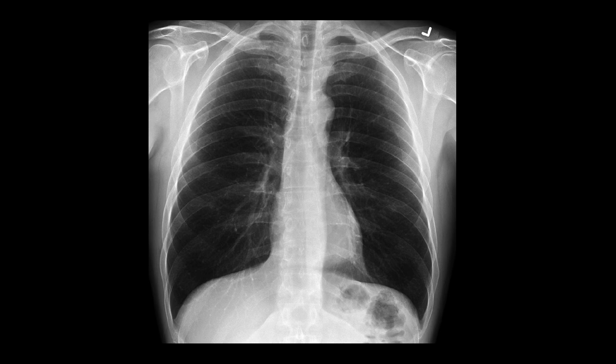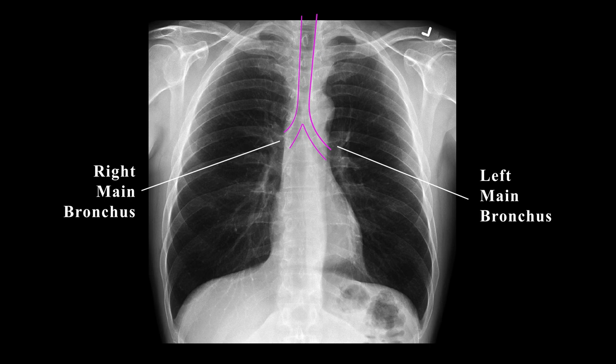Here's the trachea, typically in the middle and branching into the left and right main stem bronchi. Normally, you'll see a steeper right bronchus compared to the left.